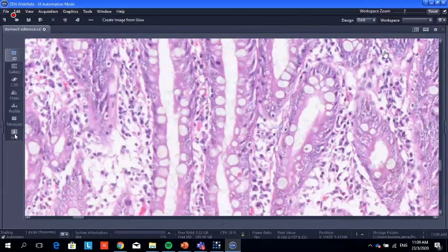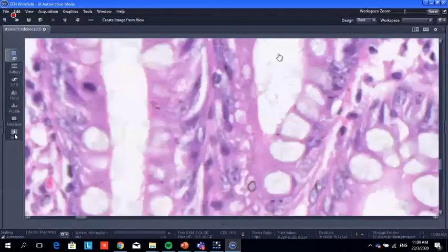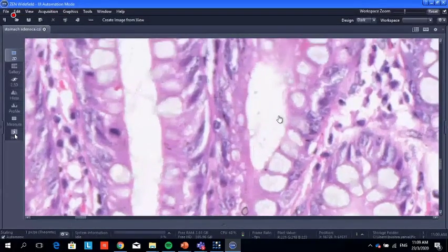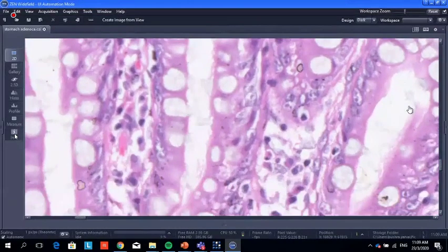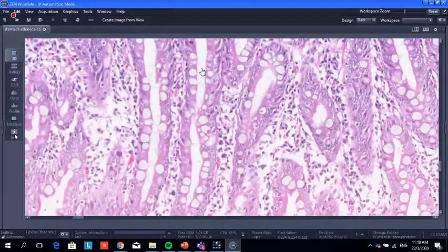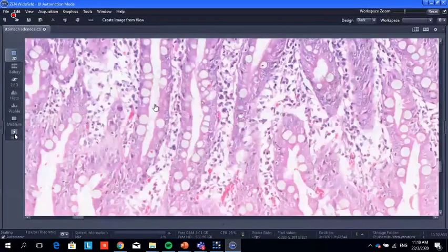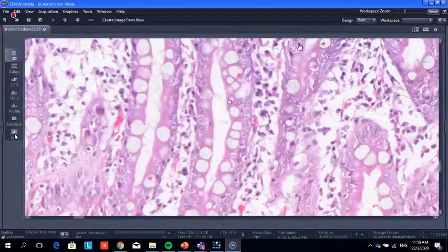Remember, I told you what these are, inside the lumen? Bacteria. Actually, in this slide it's not very clear, but I'm sure if they do the Warthin-Starry silver stain, it will be positive. We can see the H. pylori by H&E slide, but I think this slide is already a bit faded or not clear.